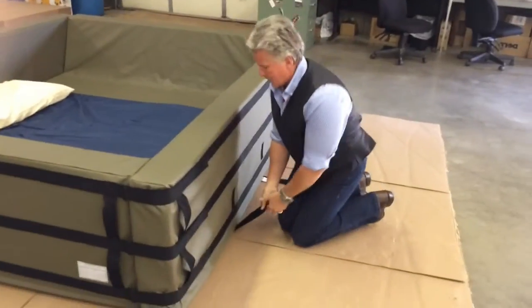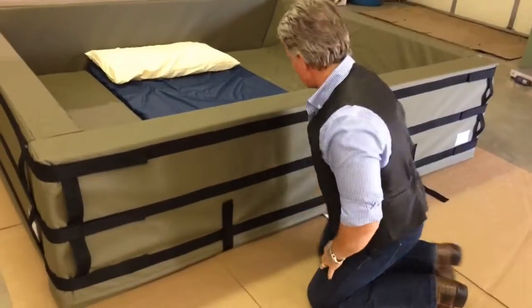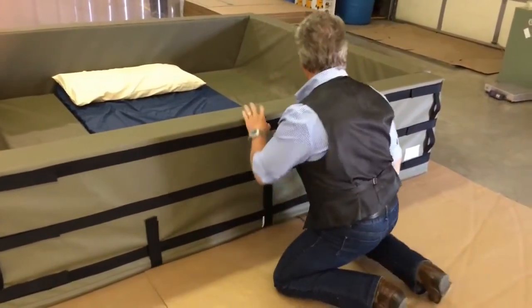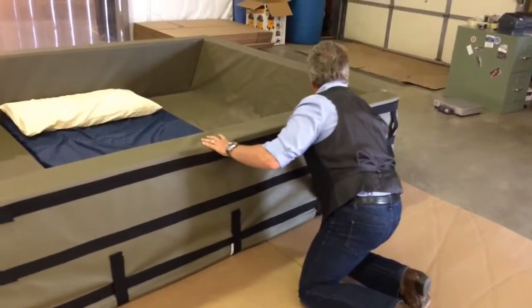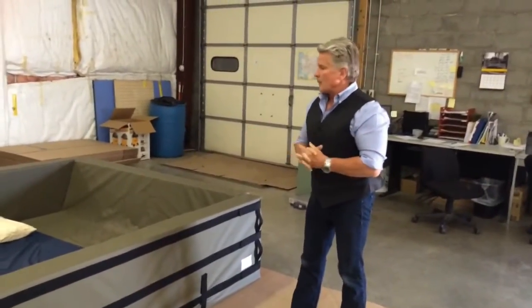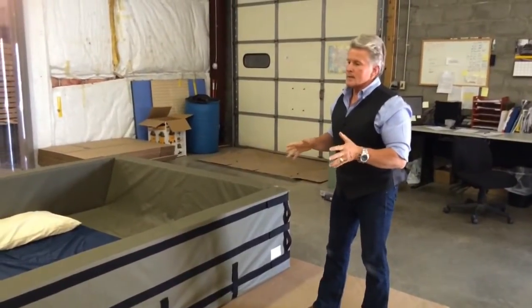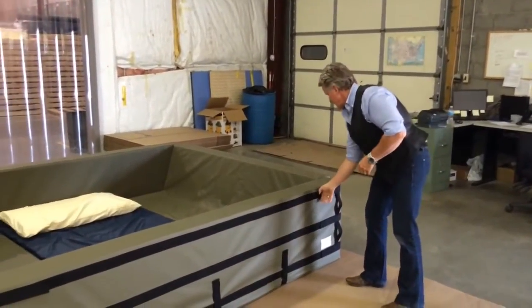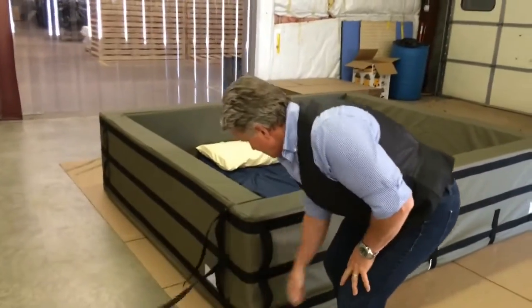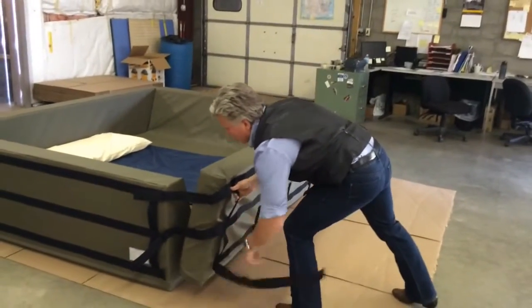These straps, again, hold the footboard or headboard to the assembly so that if they do push against it, there is more union with the entire system. And we're back to an enclosure that's going to provide that opened area for the resident that you're caring for. If we wanted to take this apart completely, I'll go on this end. Redo again the disassembly. Take this out and apart.